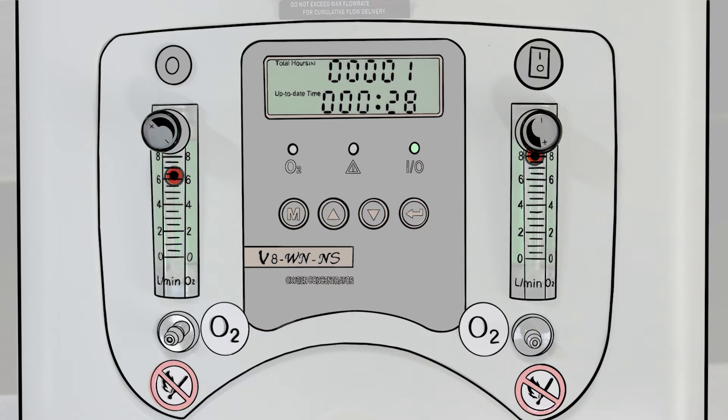So if one outlet is on 3 liters per minute, then the second one cannot go above 5. Or if the first is on 4 liters, the other can also not go above 4. The two flow meters should add up to 8 or less.